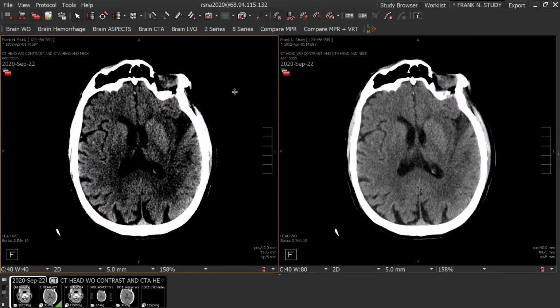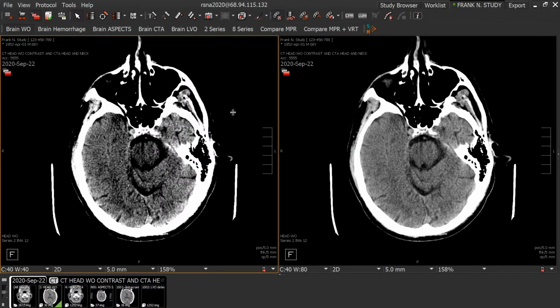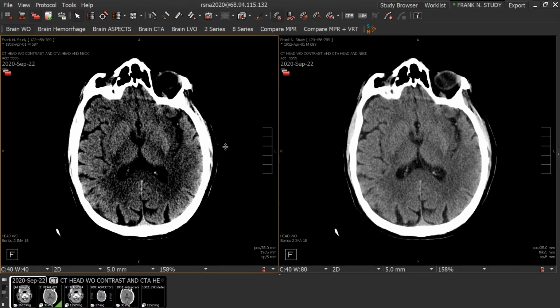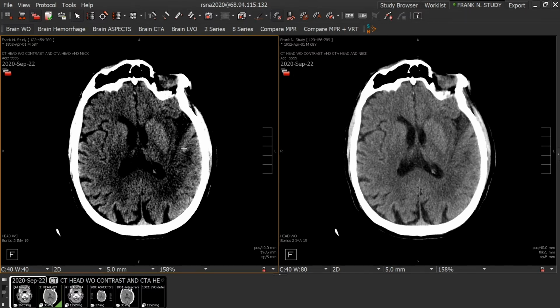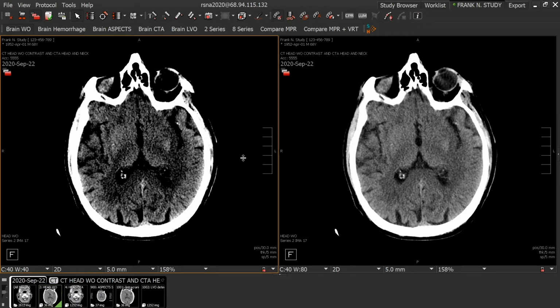To get an overview of the study, the radiologist quickly scrolls through the non-contrast head CT. It is critically important for the radiologist to do this first in order to avoid AI confirmation or automation bias, where the radiologist might be unconsciously persuaded to confirm the AI result for a borderline finding, which could result in a false positive or a false negative.